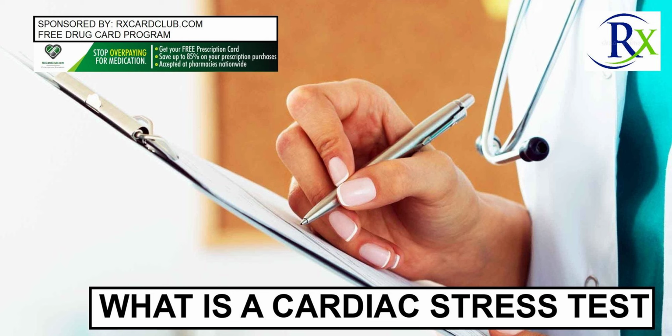Where stress tests are done. A cardiac stress test is most commonly performed in a cardiologist's office. If more specialized equipment is needed, such as an echocardiogram, sometimes used to support the test, you may be asked to go to a hospital. The room itself is called a stress lab.